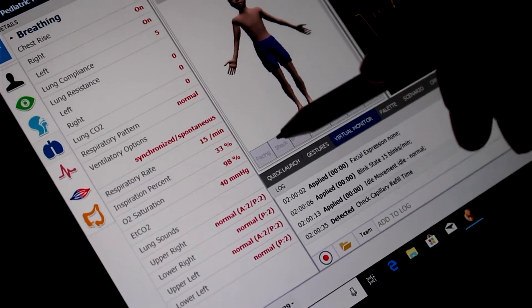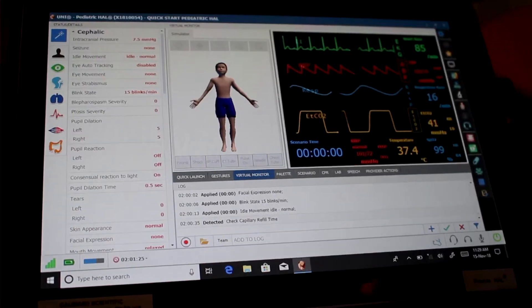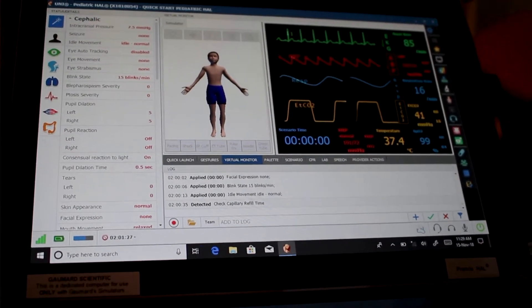You can change his skin colour — so if you want him to be cyanosed, you can make him have a blue face. It's all operated on a tablet here, which works via an RF module.